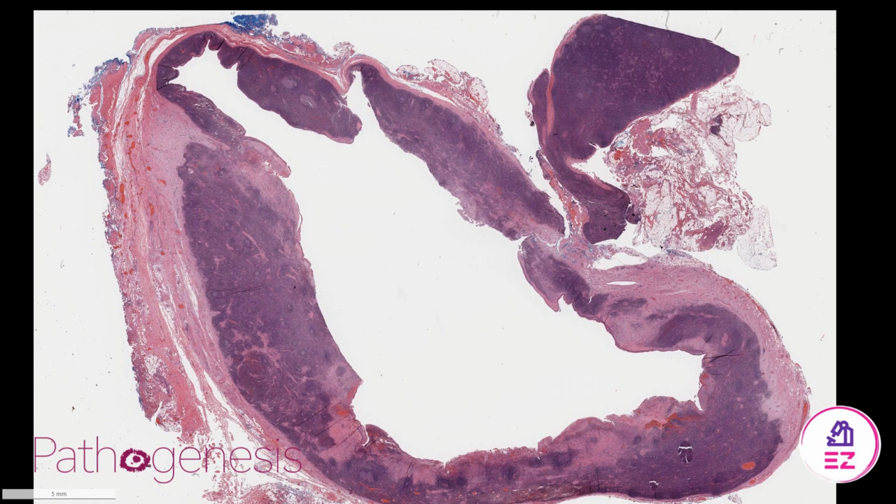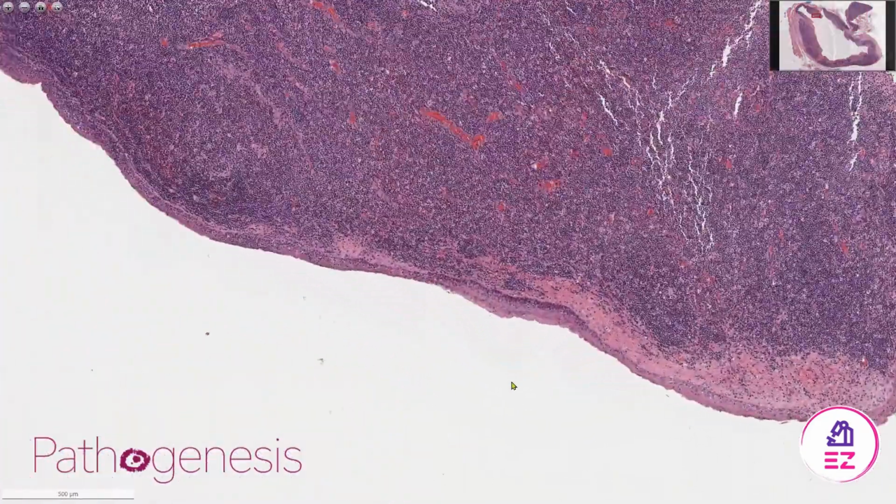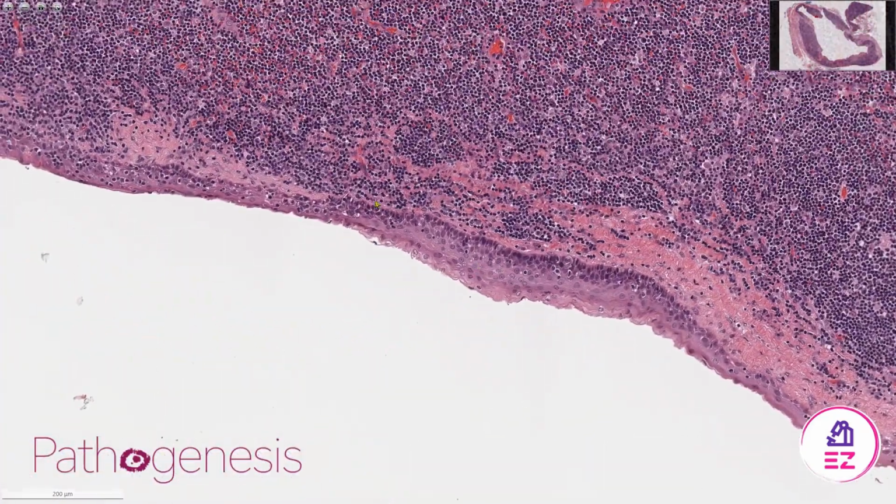Today's example is a branchial cyst. So this branchial cyst occurred in the lateral part of the neck in a fairly young patient, which is the classic presentation for these types of cysts, and they're developmental. So it has the usual parts of a cyst. So it's got the cyst wall and epithelial lining, which I'll show you in more detail, and then the middle, which is the lumen.